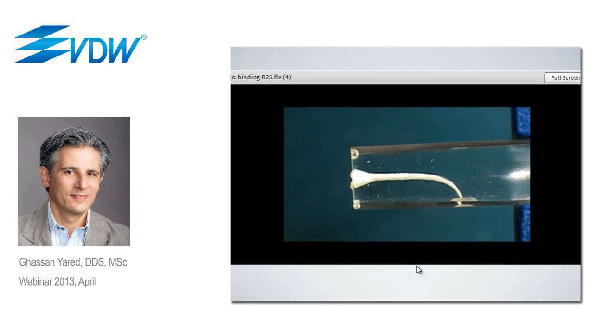This is not how we use the Reciproc instrument, but this is a video I wanted to show just to make you understand the efficiency of the concept and the issue of torsional fatigue and binding.